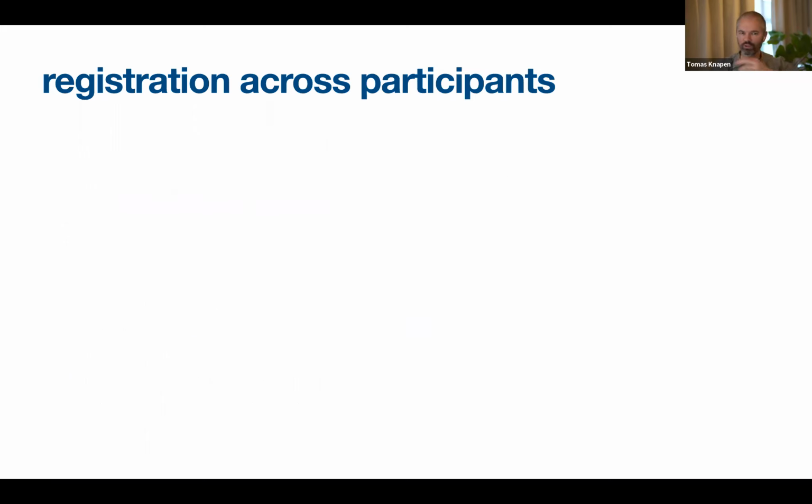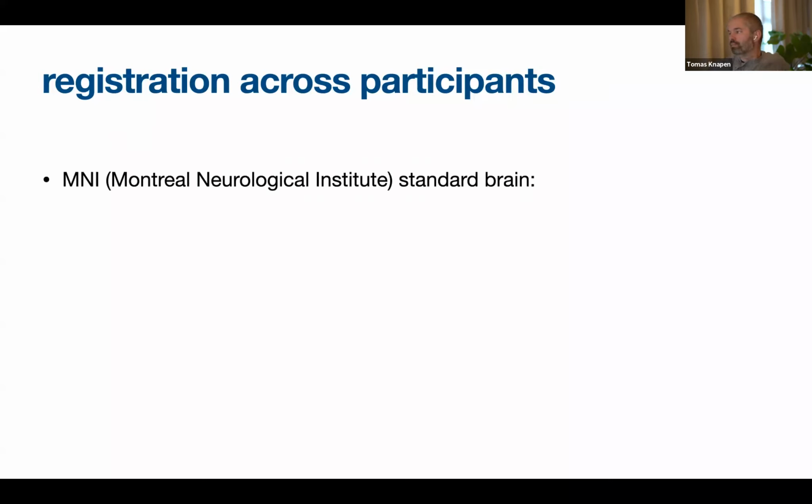So, registration across participants. If we do this in the volume, people tend to use a template, a standard brain, and there are multiple standard brains, which is kind of a misnomer, of course.